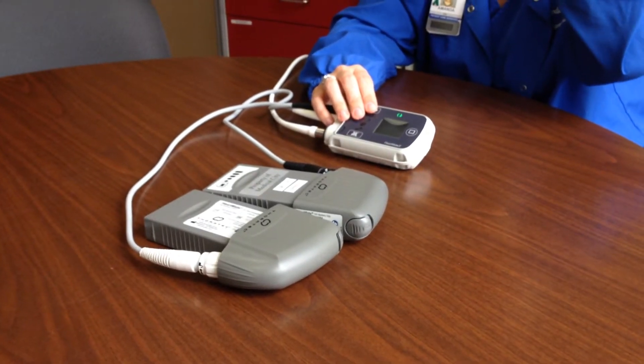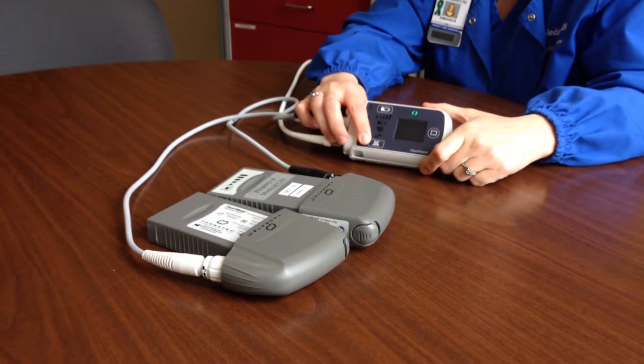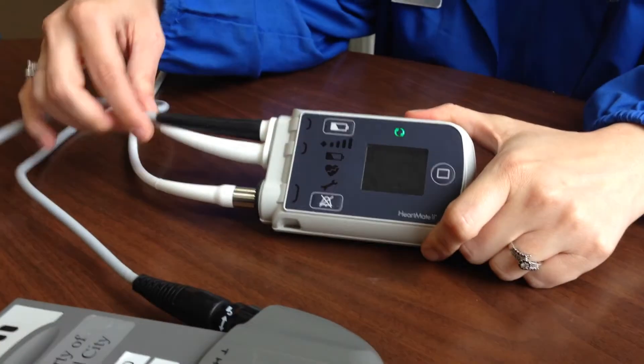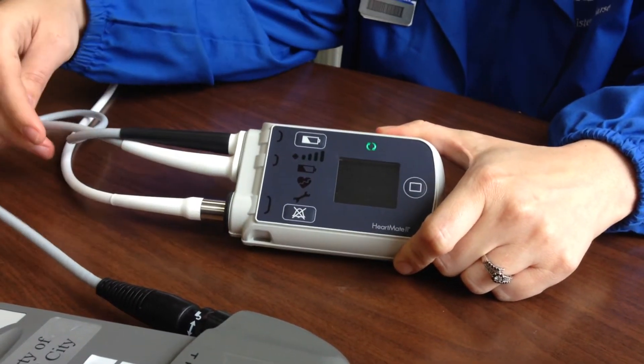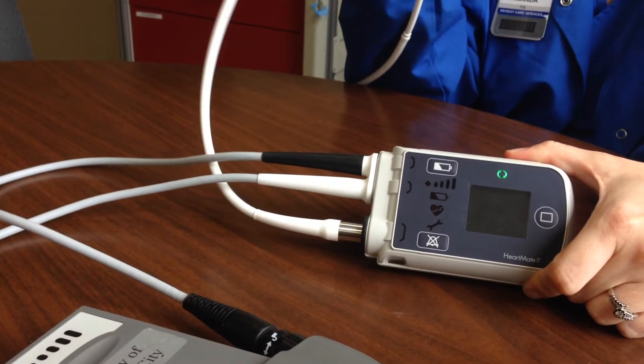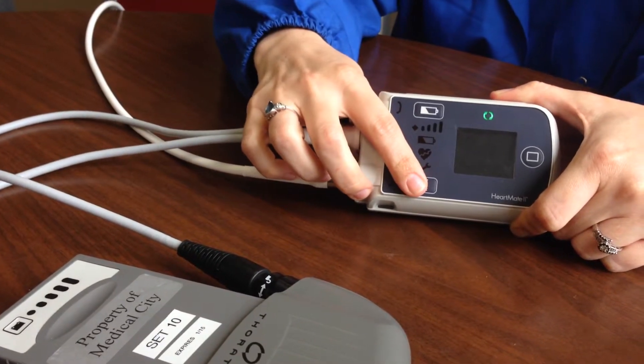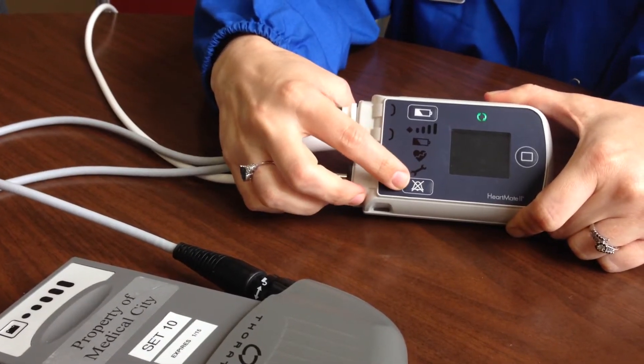Once you realize the patient has passed and needs to be removed from support, the biggest thing is to keep this as quiet as possible, because you have to disconnect three different areas of the LVAD. There are two power connections and then the actual driveline which is connected to the patient. The trick is keeping it quiet using the mute button on the bottom.